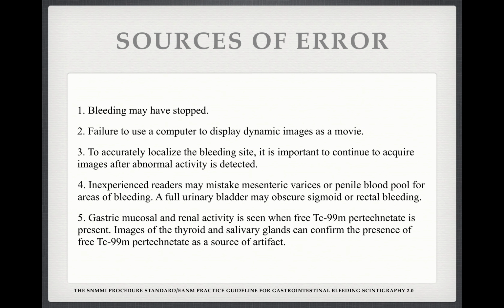Okay. Sources of error in general, most errors that I see occur due to poor labeling that is performed at night. So we'll see a lot of gastric mucosa from the free tech, as well as failure to look at the study on the dynamic cine images.